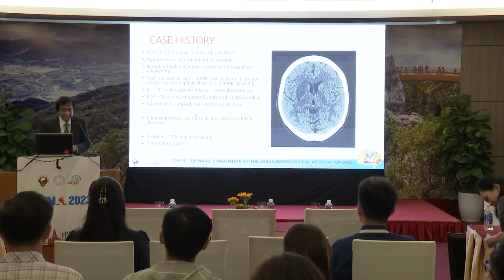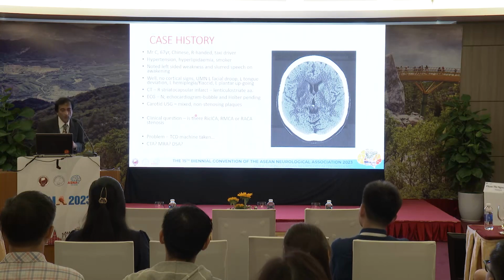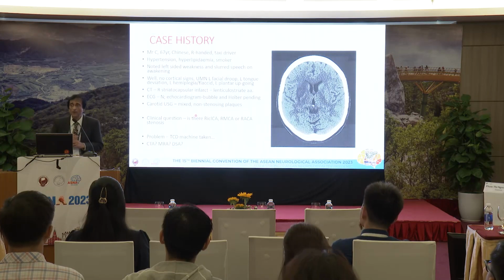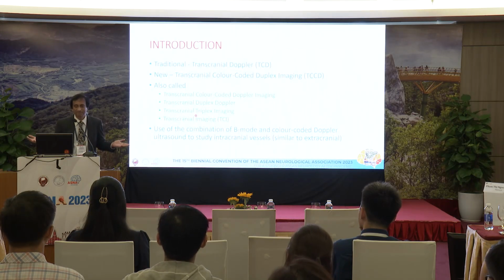You want to do TCD, but the machine is gone for repair, so you can't use it. What else can you do? There are a few ways of looking at the brain: CT angiogram, MR angiogram, full angiogram. Why bother, when you have the answer, TCCD?